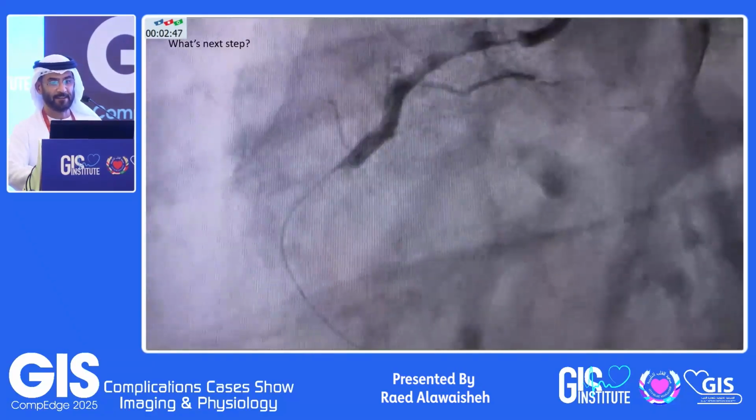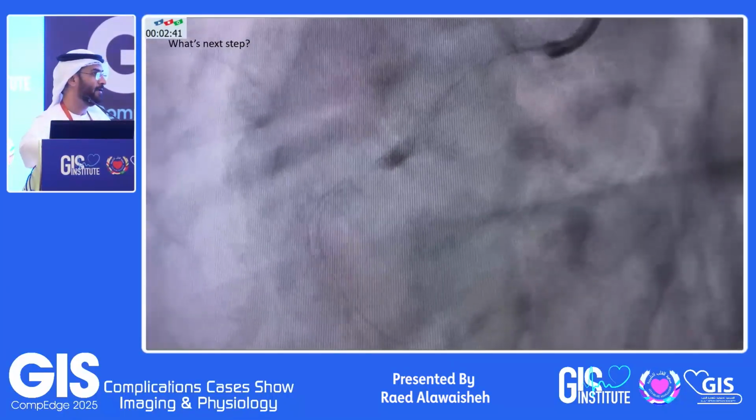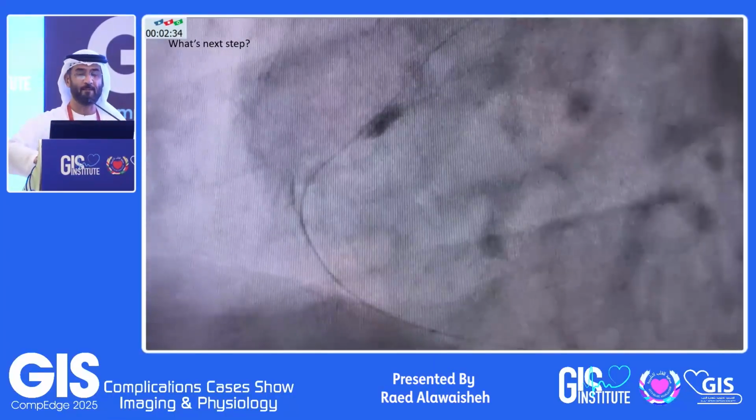And after he was happy, he made an injection. Now, he saw this one. So what is the next step? There is a perforation now. It's not huge. If you see this in the cath lab, what is the next step?